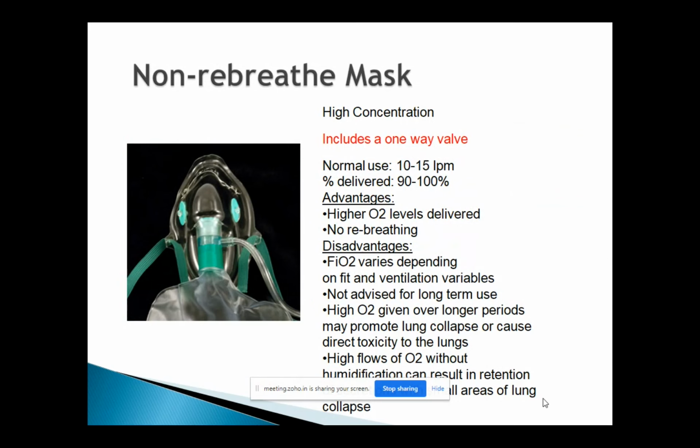So the advantage is every time patients breathe in, the oxygen comes from the bag. When they breathe out, the valves on both sides open up and allow the carbon dioxide, the patient's exhaled air, to go out. When they breathe in, the valve shuts back down again, and then the oxygen flows again from the bag. So there is very, very minimal chance that patients will breathe in what they breathe out.